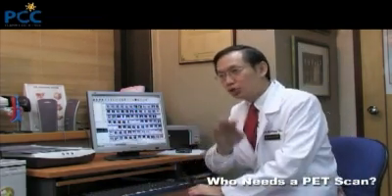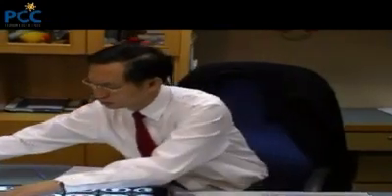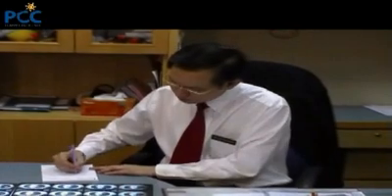Because of the extreme costs involved in a PET CT, the doctor must make a decision on who needs a PET scan and who doesn't need a PET scan. I think we'll be abusing technology if, let's say, for every patient who says, look, I'm worried, I'm neurotic, I'm a little bit concerned whether I've got cancer, and then I go for a PET CT scan.